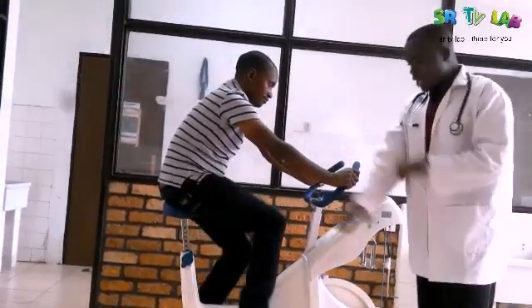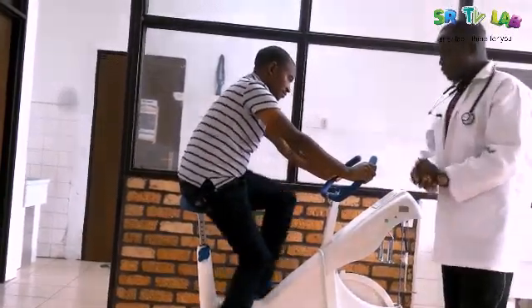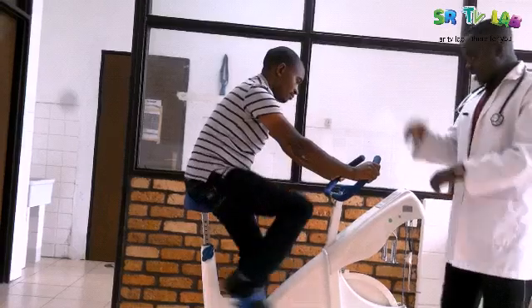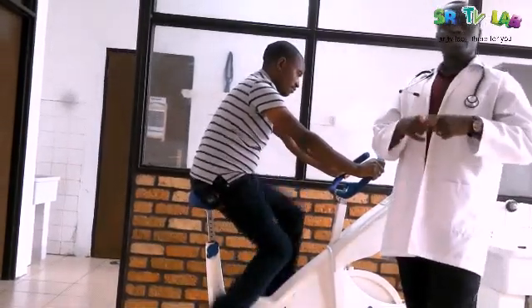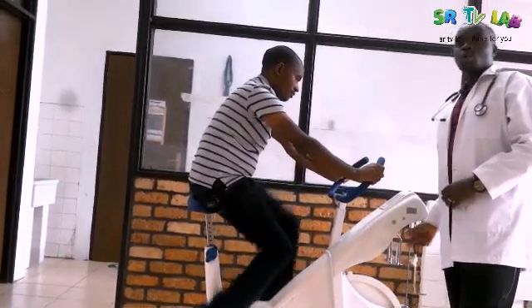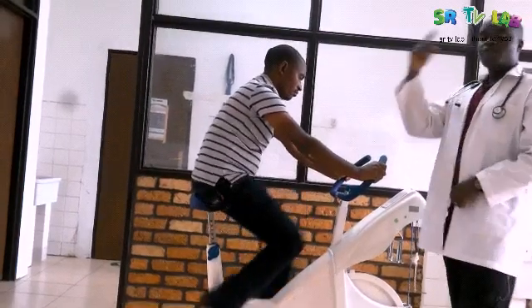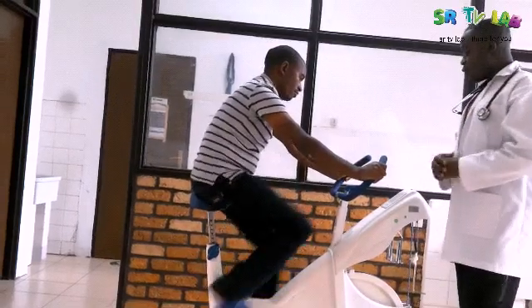Our patient is going to cycle this bicycle at a pace of just 60 cycles per minute, which means one cycle per second. After two minutes, we will put weight on this bicycle to add some resistance. After every two minutes, that is how we are going to do it.